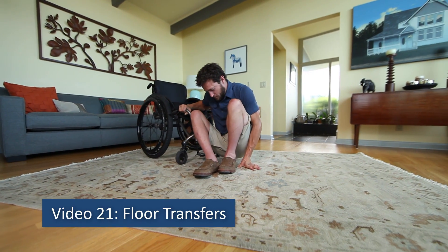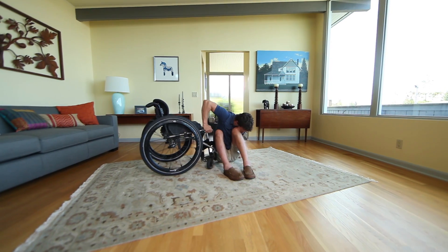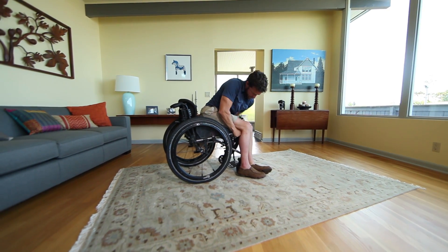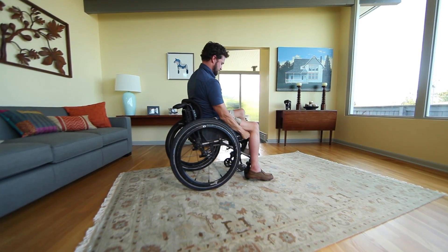Video 21, Floor Transfers. The ability to transfer between your wheelchair and the ground is hard on your shoulders, but it provides options when help is not available.